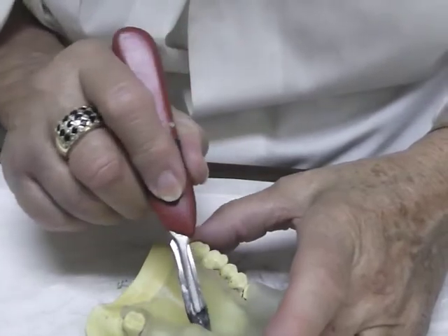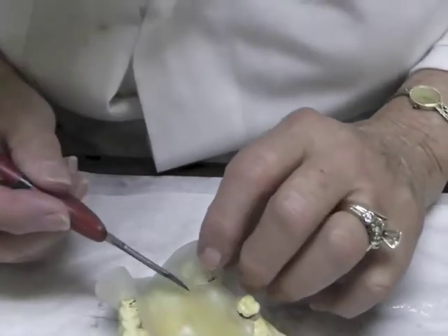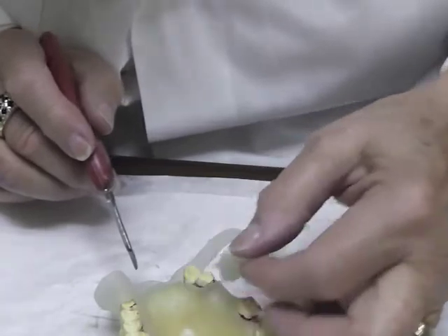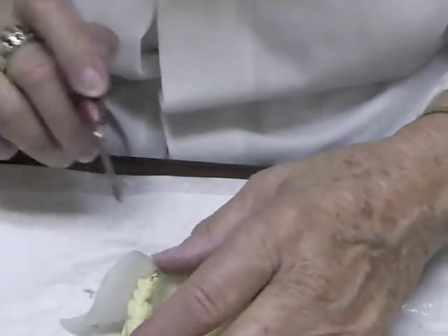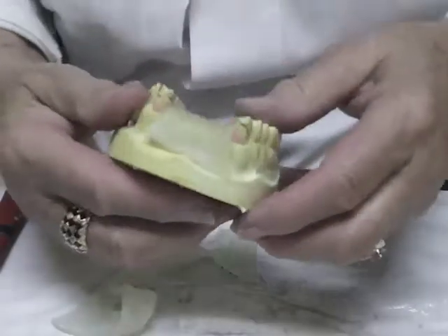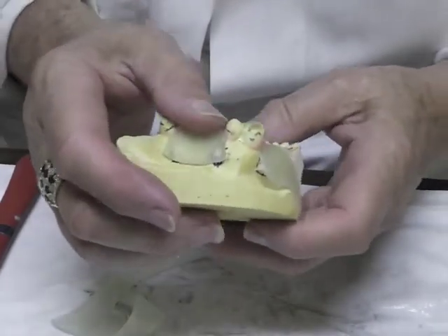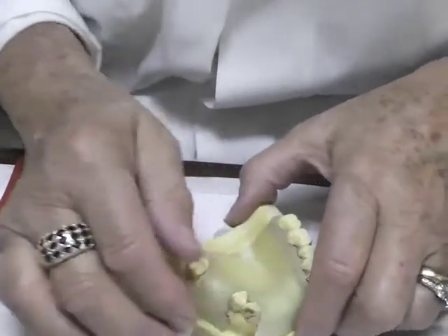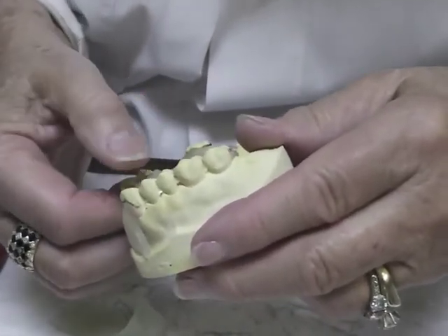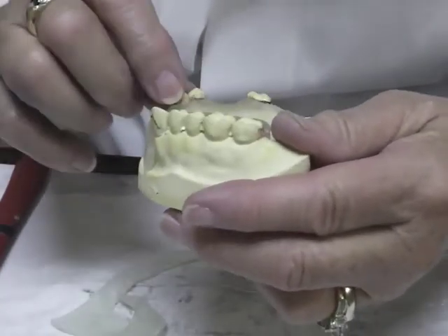I'm going to come across these teeth — I can see that black outline. I'm going to go down this front section and take away this excess. I'm going to come over here and come down this front section, leaving a little bit too much at first just to make sure I've got enough. Then I'll adapt my material lightly.